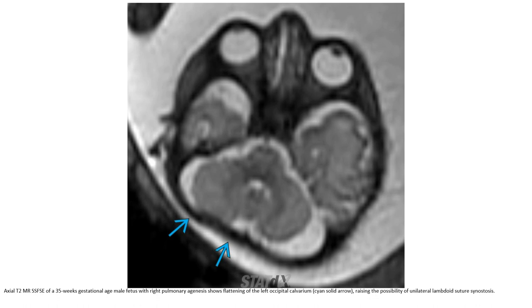This is a T2 RSS FSE MRI of a 35-week gestational age male fetus with right pulmonary agenesis, showing flattening of the left occipital calvarium, raising the possibility of unilateral lambdoid suture synostosis.